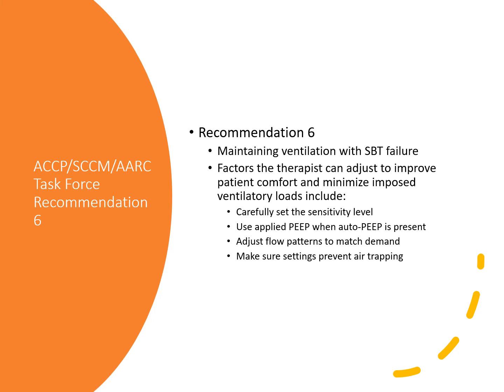As long as the patient is not participating in the work of breathing and the workload is not fatiguing to the patient, they could breathe spontaneously as well. So it depends if you have them in a proportional assist ventilation mode. But repeated spontaneous breathing trials the same day have been shown to have no benefit unless it was a sedation issue or something like that, right? So just repeating ritualistic attempts at the ventilator settings is not worth the time or the effort in the adult patient population currently.